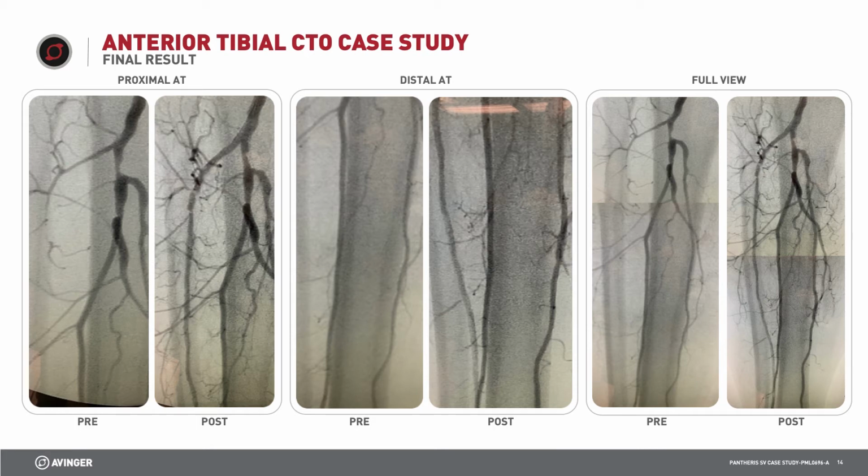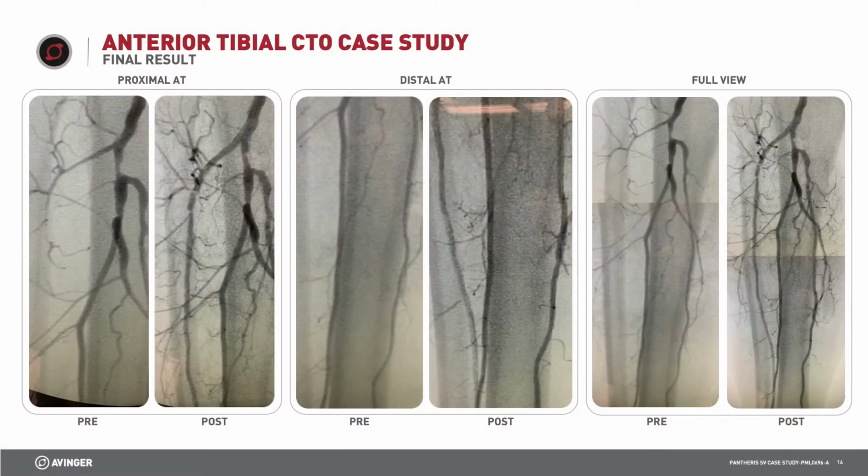There's no post-atherectomy balloon on this case. And I will tell you that that's probably the only case in the last 2 years that I haven't followed an atherectomy device with a balloon. But if you look at that final image and how that anterior tibial artery looks like the native vessel, and there are collaterals coming off of that artery, I could not justify placing a balloon down there and risking a potential dissection. We did standalone atherectomy and got that outcome.